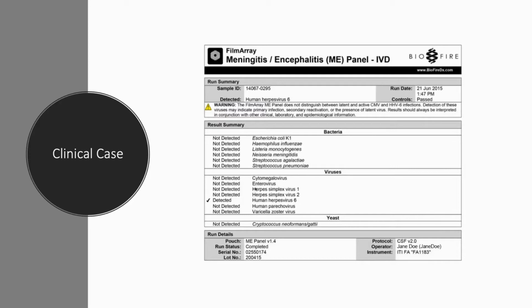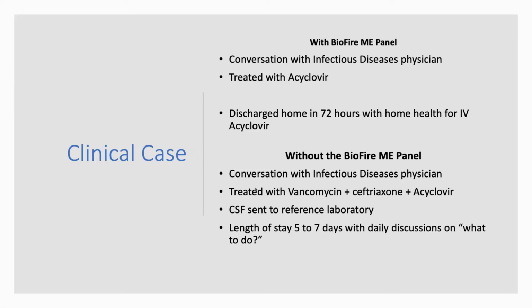And the call and the conversation that I had with the emergency room physician was, hey, Dr. Siddiqui, I've got this gentleman. We tapped him. BioFire came back HHV6. What do you want to do? That was the conversation we had. So we started acyclovir right away. What happened? The next day I rounded on the patient. This was probably about 7, 8 o'clock at night.